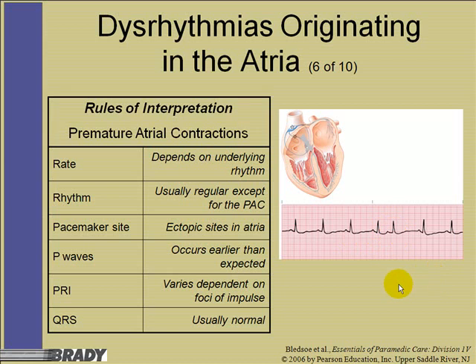So the rate's going to vary, depends on the underlying rhythm. So again, we're only looking at 6 seconds out of a full minute here, so rate's going to depend on that.